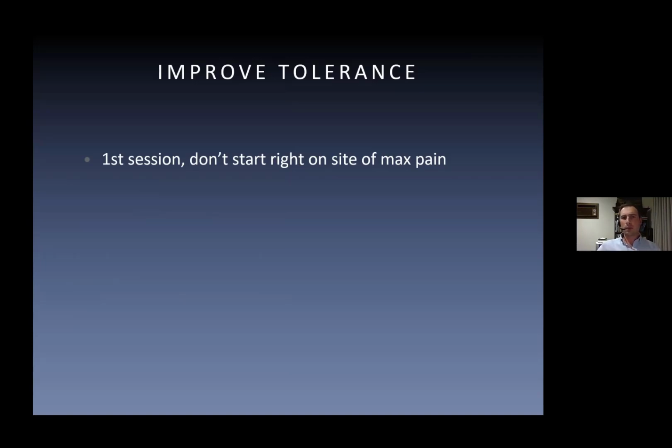It's also really important to explain things to patients beforehand. I'll say, look, shockwave can be a bit uncomfortable, and sometimes that first session can be the worst because it's when everything's most sensitive. But it's okay. I'm going to start on a really low intensity, and I'm going to talk to you throughout, and we're going to gradually increase that, but you're in control. If you're feeling too much discomfort, you just let me know and I'll turn it down a little bit.